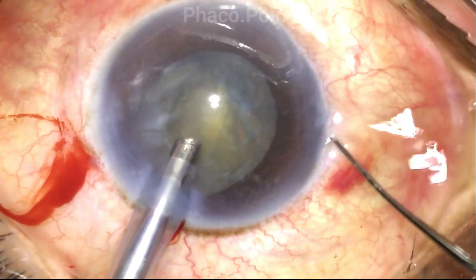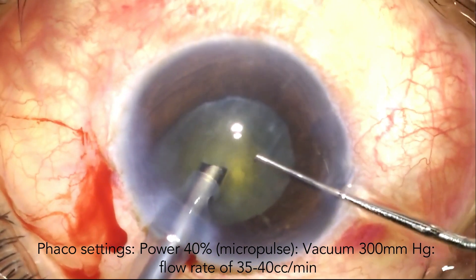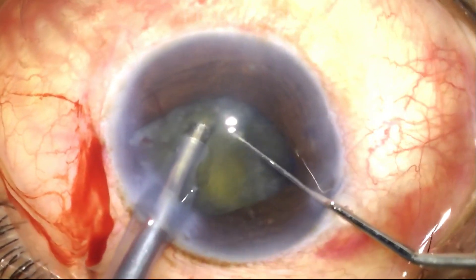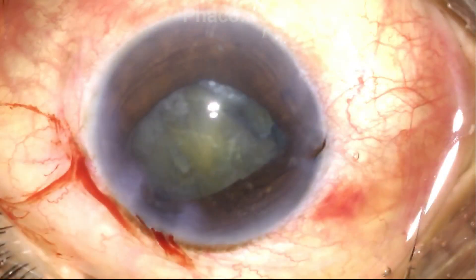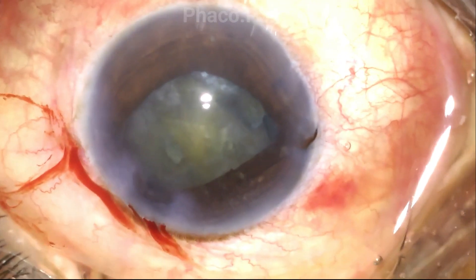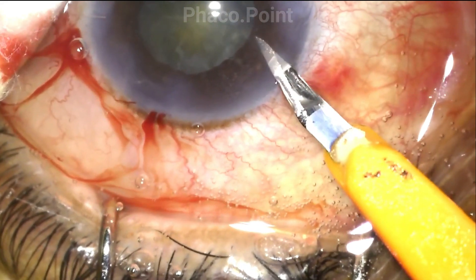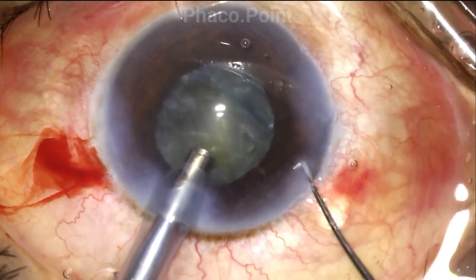I plan to perform the direct chop technique. The settings I'm going to work with are about 40% phaco power, a vacuum of 300 mmHg, and a flow rate of about 35 to 40 cc per minute. At all points, I need to be vigilant and ensure I do not damage the inferior rhexis edge. Because the side port was created in the previous surgery and was a little larger than what I would use, there is an obvious tendency to iris prolapse. I therefore choose to hydrate this side port, create a new side port incision, and proceed using this newly created side port for the second instrument for the rest of nucleus management.